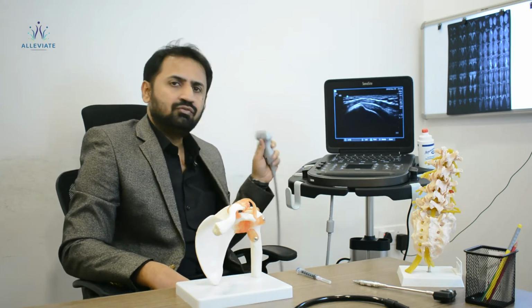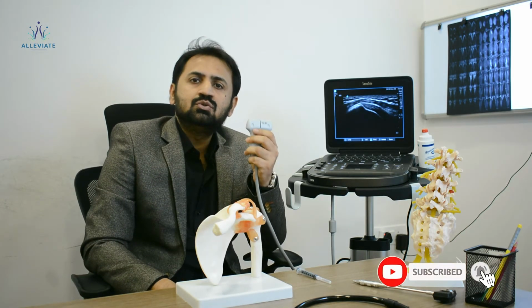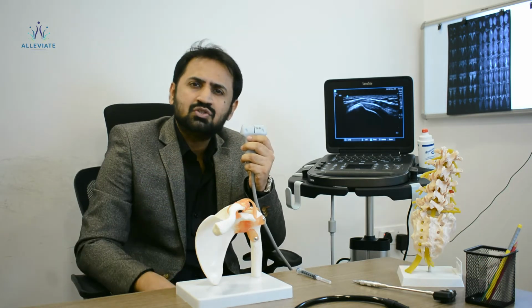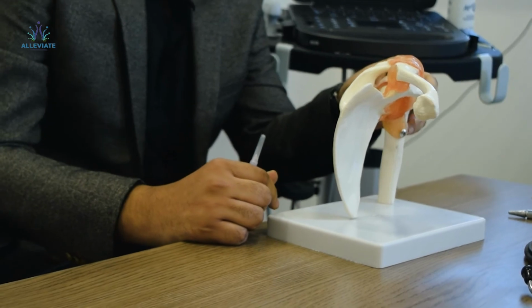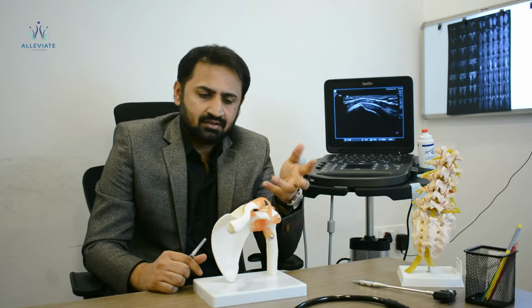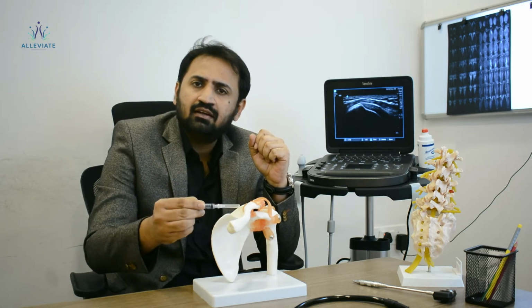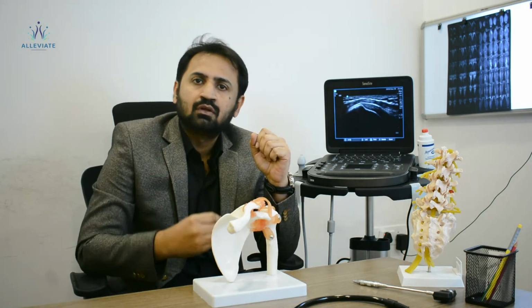For the purpose of ultrasound of the shoulder, we will be using a linear high frequency probe, because all the structures around the shoulder joint are quite superficial. In the rotator cuff, there can be tears, partial tears, bursitis, adhesive capsulitis, and even acromioclavicular joint arthropathy because of degenerative changes. An intervention like a suprascapular nerve block can be done under ultrasound guidance. It becomes easier and more precise.